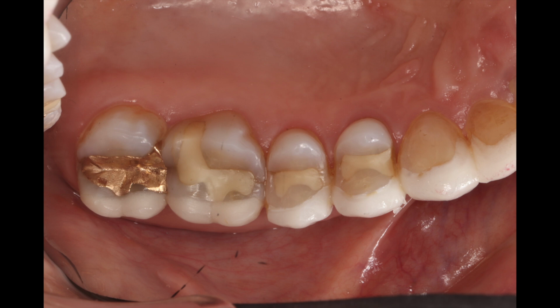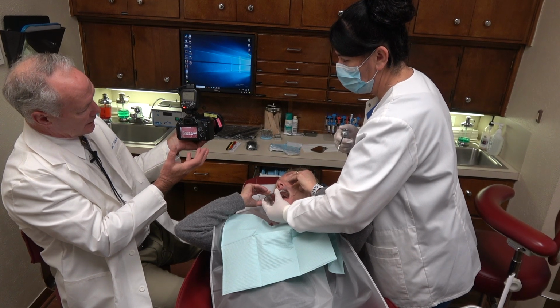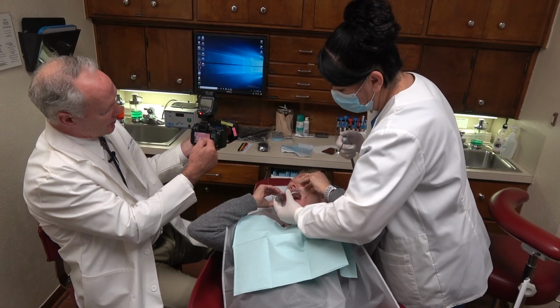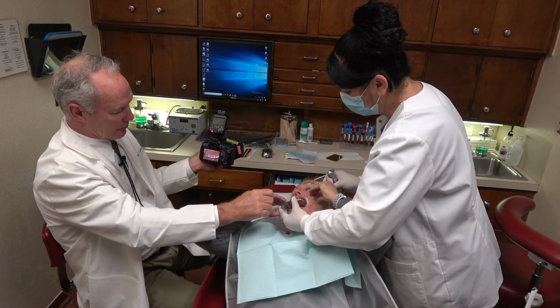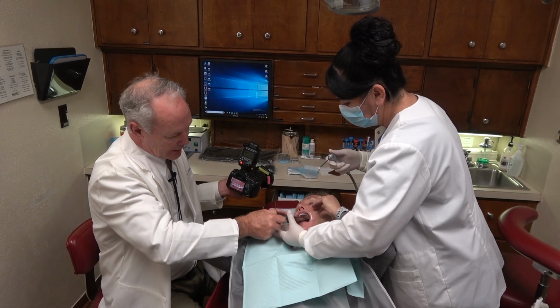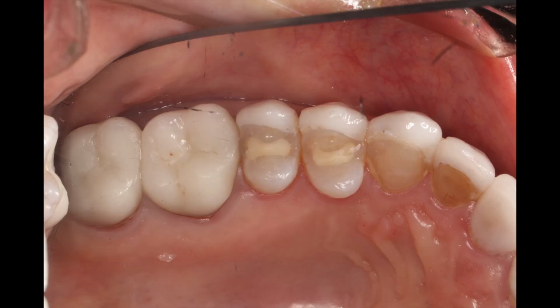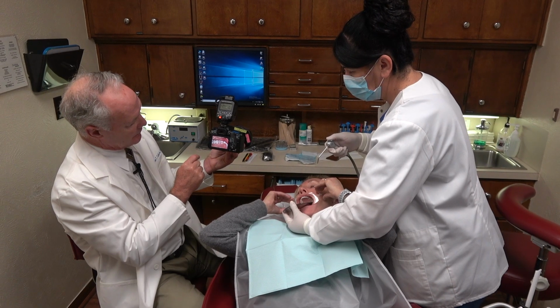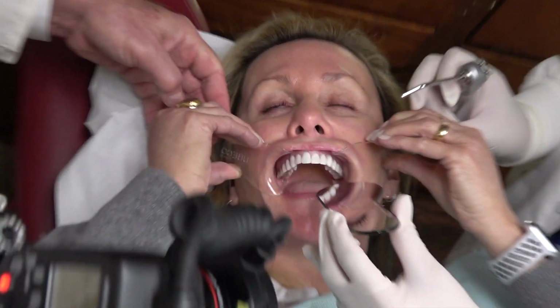Now when you take this view, you want to take it straight on. Straight on, not at an angle. So if the teeth have cracks or there's leakage around fillings, you can see that. You don't want to take an angled view. You want to get the mirror so that you're taking a view straight on at a right angle. It's a right angle so I can see any cracks, leaky fillings, anything like that, okay? Now come up this way just a little bit, perfect.